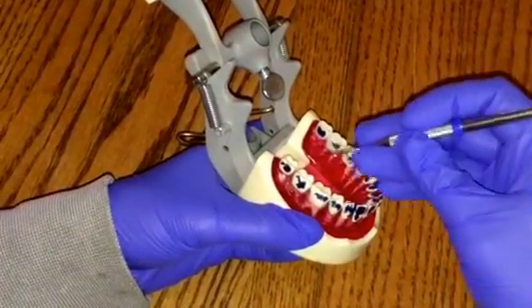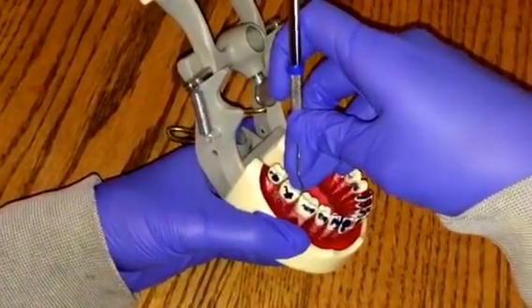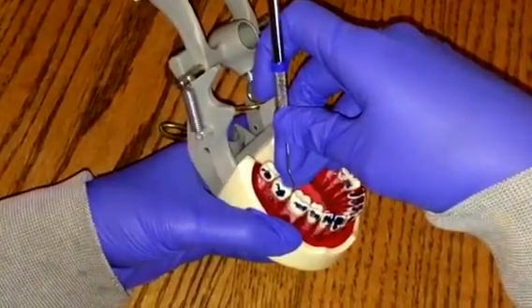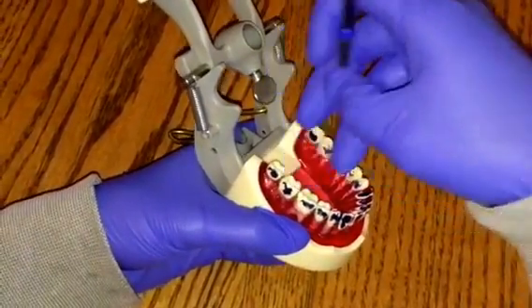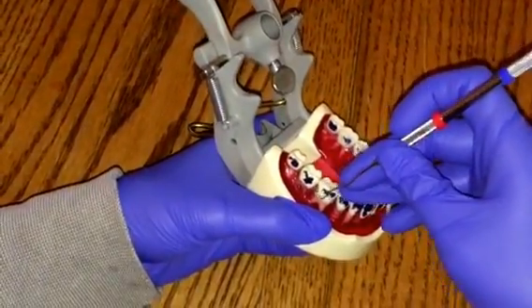If I were to choose this other end, making the terminal shank parallel, the handle would be going towards the patient's throat or ear, and that would be the incorrect end selection. So this here is the correct end selection.